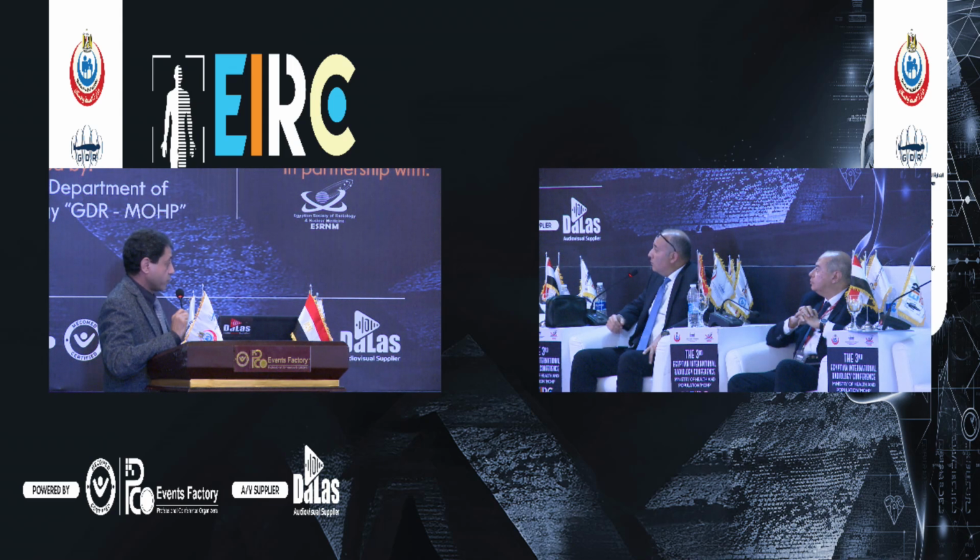This is an advantage for prostatic artery embolization, actually. I'm talking about the technical difficulty. No, on the contrary, it is easier, because the prostatic artery becomes more hypertrophied with a larger volume of the adenoma, the larger the prostatic artery. So it is easier for us to catheterize it and do the embolization. Yes, it is easier.